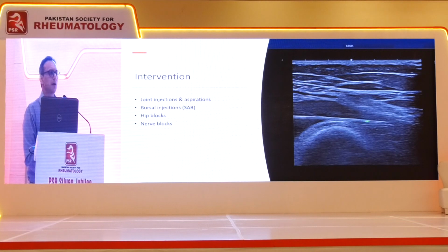And a lot of the time, again, the question is asked: do we really need ultrasound for aspiration injections? The answer is no. When I was trained, I never used ultrasound. I did them blindly. If I can see something, why would I do it blindly? If I have a probe by my side and I can see where I'm putting the needle, why should I do it blindly? I don't think I should. So that's why I use ultrasound to look at where I'm going exactly and do things accurately.